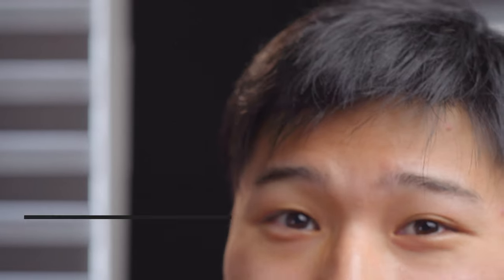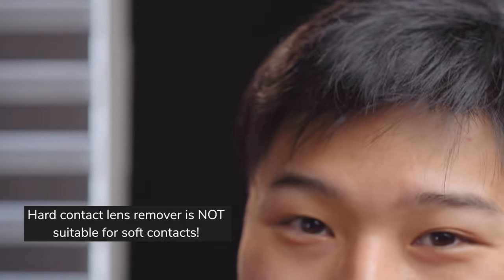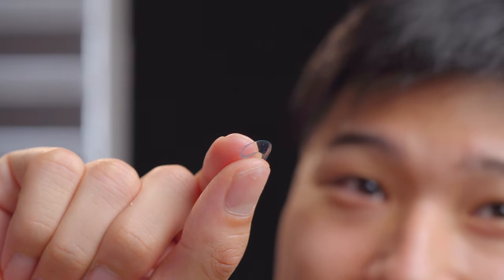Hey! At this point, I would say that a hard contact lens remover is not suitable for soft contact lens wearers — and hopefully you can see the reason why. To safely remove contacts, bring down the lower eyelid using the opposite hand, drag the lens down, and if it's dislodged, you can simply pinch it off. As easy as that.